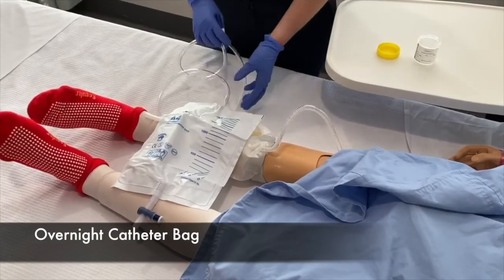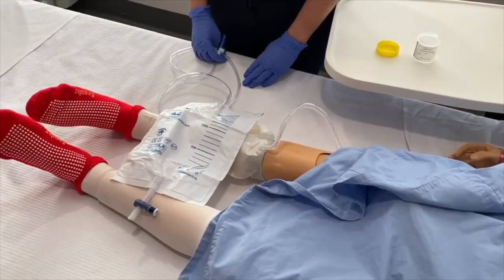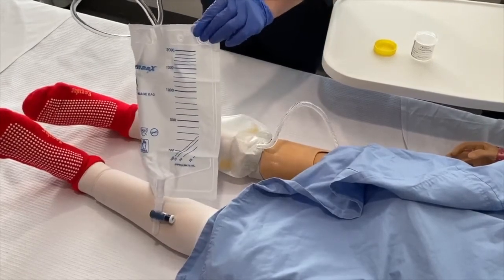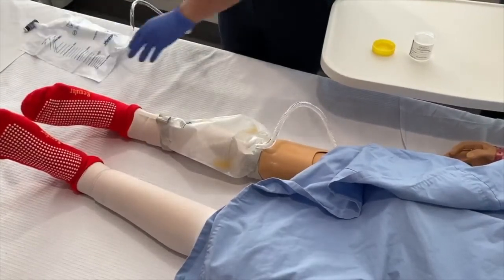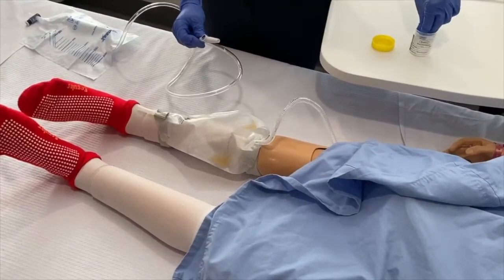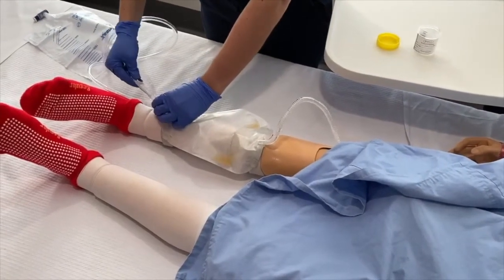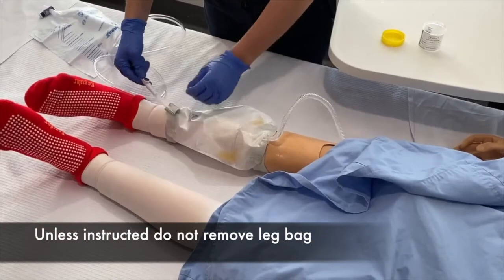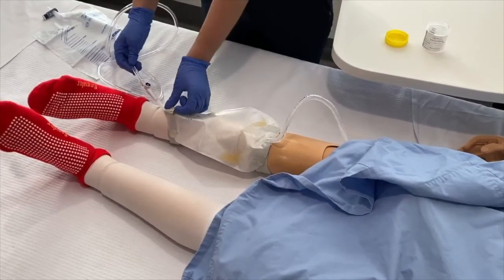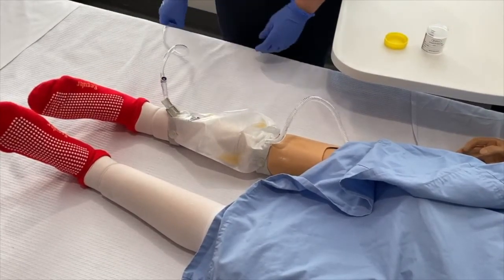This bag will be used overnight so you do not have to get up to empty your leg bag during the night. The bag can hold two litres of urine. To use this bag, start by performing hand hygiene. Then remove the blue tip from the top of the catheter and place in a container as shown. Connect the night bag to the bottom of the leg bag. Remember, you never remove the leg bag unless you have been instructed to. Open the tap of the leg bag so that the urine can drain freely into the night bag.